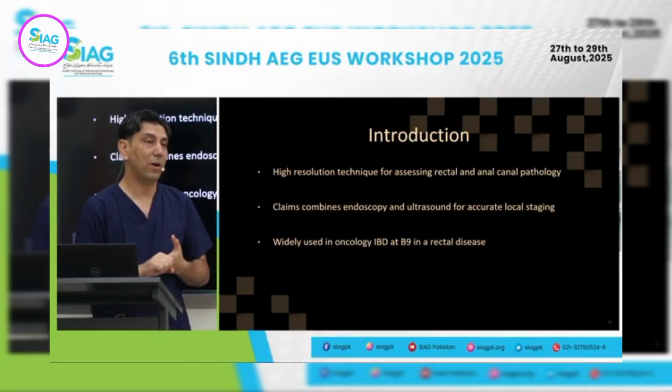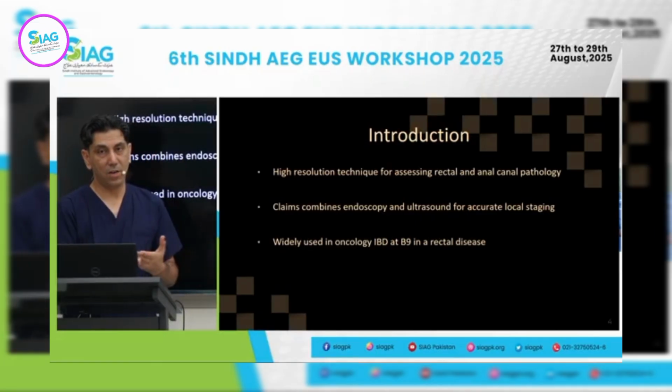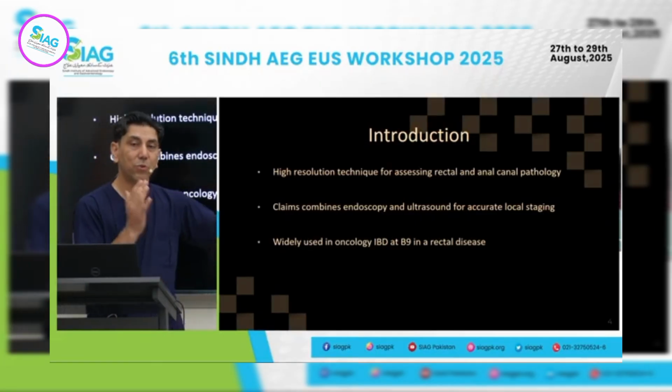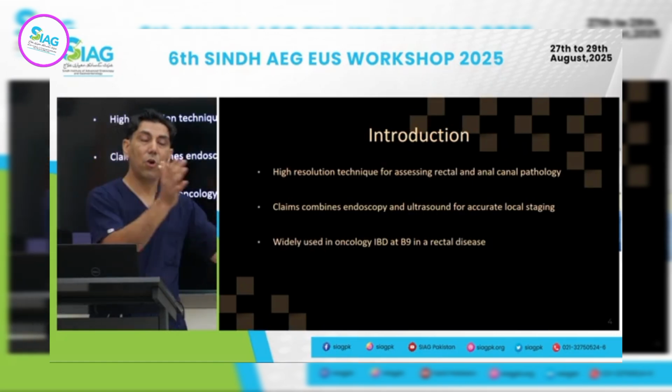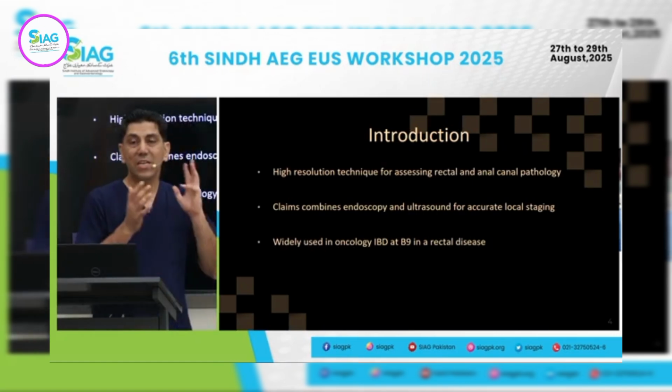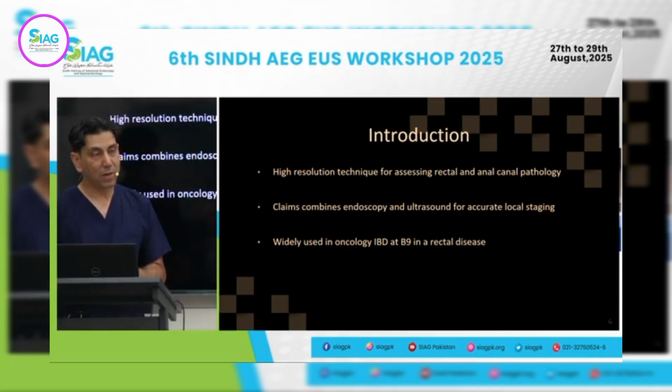Yesterday we also talked about three-dimensional ultrasound. EUS is usually a two-dimensional modality, but with the advancement in the technology, we are now looking at performing 3D endoscopic ultrasound.